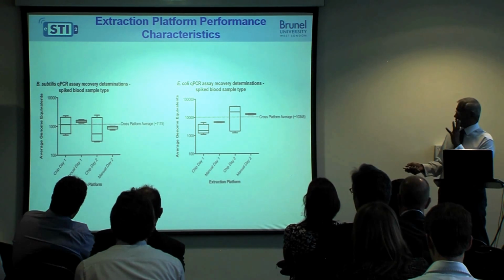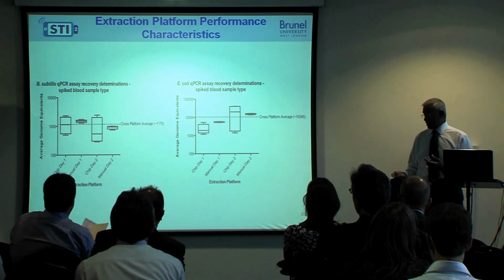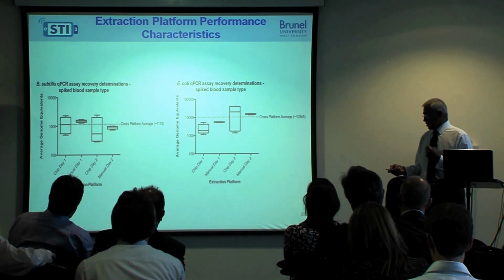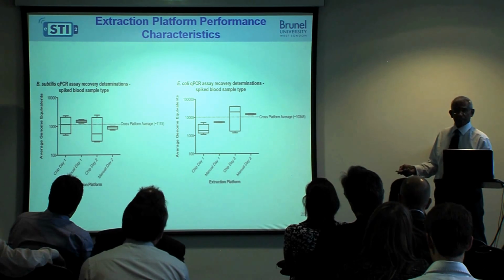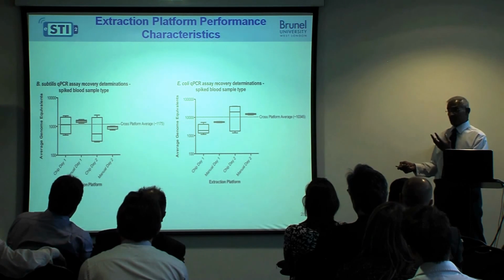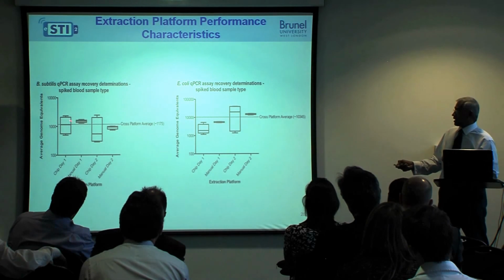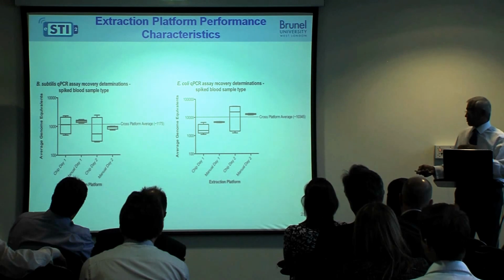And just to show you one simple result, because whenever you do these things, you need to compare with the gold standard benchtop standard. The benchtop standard here is a QIAGEN column for extracting the DNA. So we checked against this, and in fact this was done as an independent test at LGC in Teddington. They took our device. They are very familiar with how to extract DNA with the QIAGEN kit. And what you see here are these average values. This is the actual QIAGEN kit results. This is our chip results. Again, for different pathogens, you see it's fairly comparable in terms of extracting the DNA.